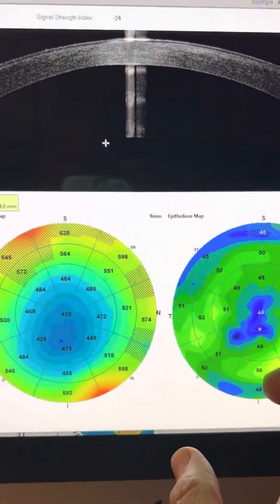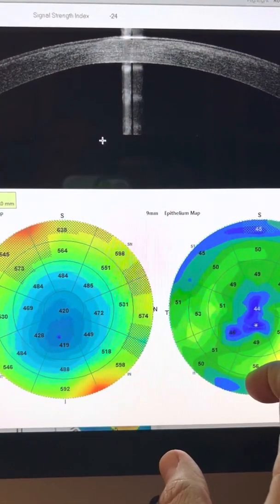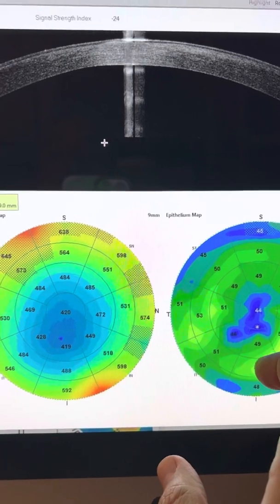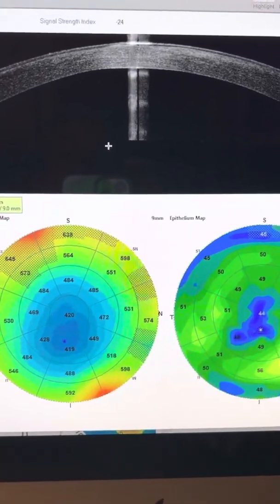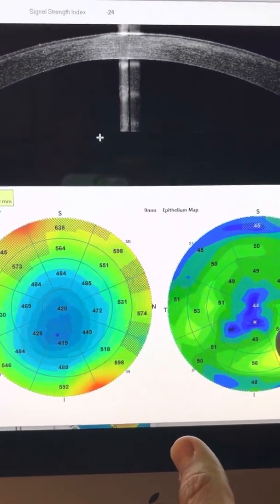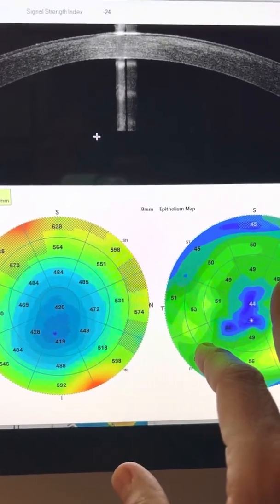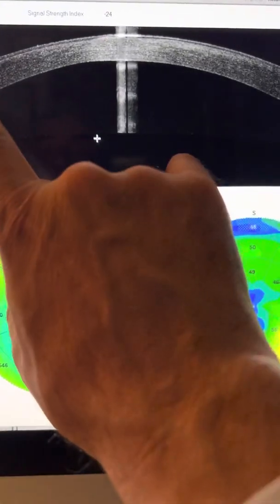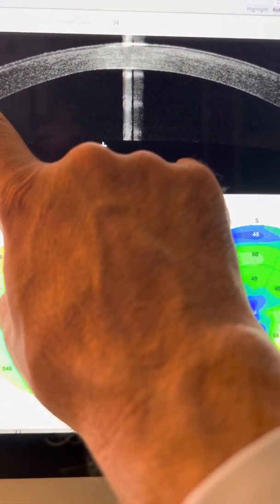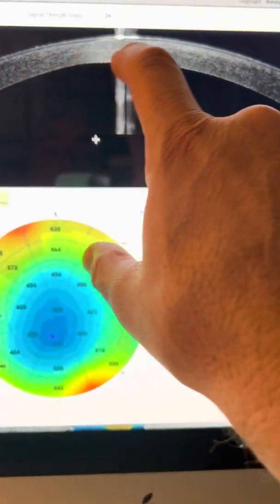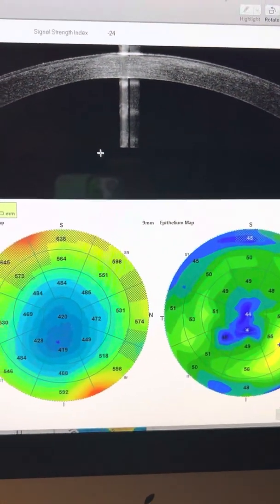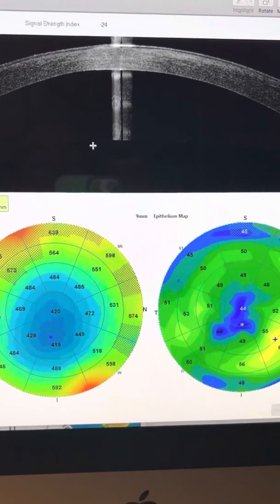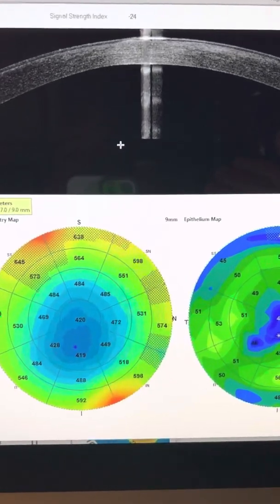So we don't know what CXL protocol was performed with this type of Athens protocol case. But we have presented several times that the actual CXL line is very uniform and about 60 to 70% in depth in our Athens protocol cases.